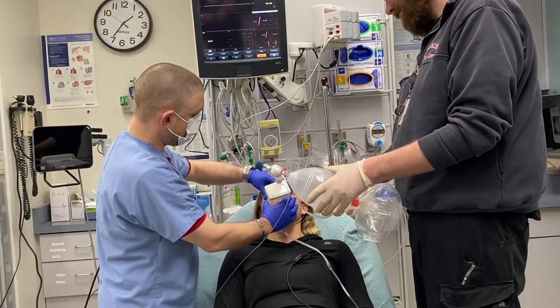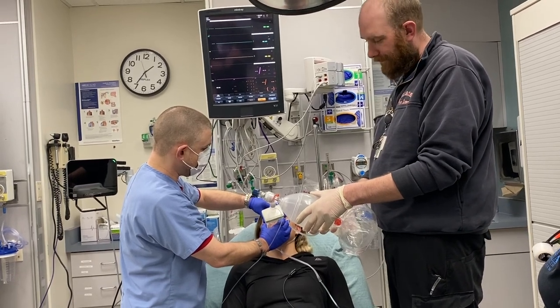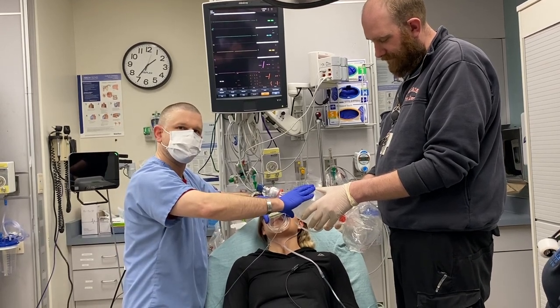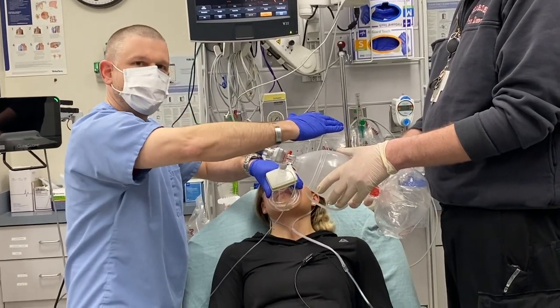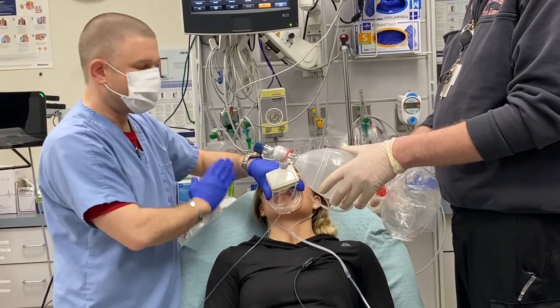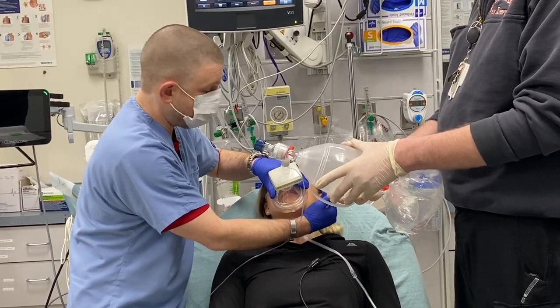Jordan, how do you feel? Can you breathe okay through that? Do you feel like you're getting good enough breaths as you breathe in and out? Okay. So there's no need to squeeze this bag. The only thing you're going to do is insufflate the stomach. Don't squeeze. This whole unit here is an antiviral filtered, high-powered CPAP unit that does not cause any environmental exposure except for what will leak out of the side of the mask.